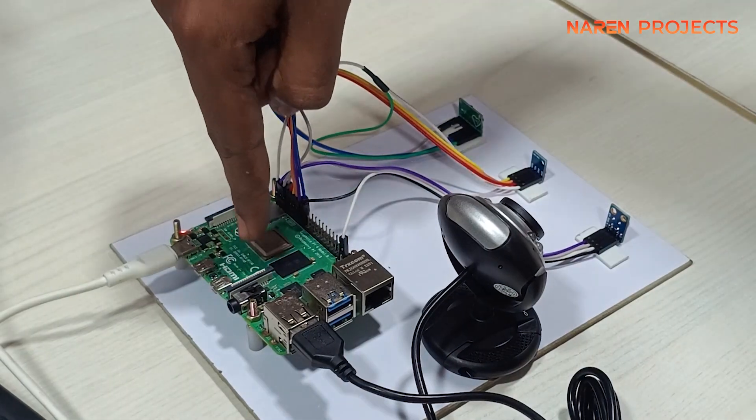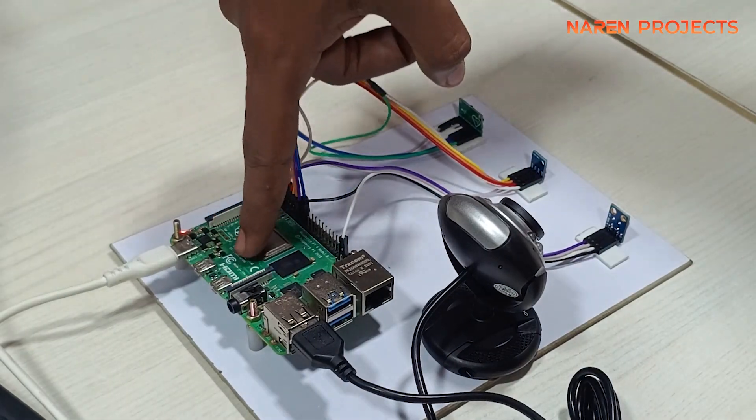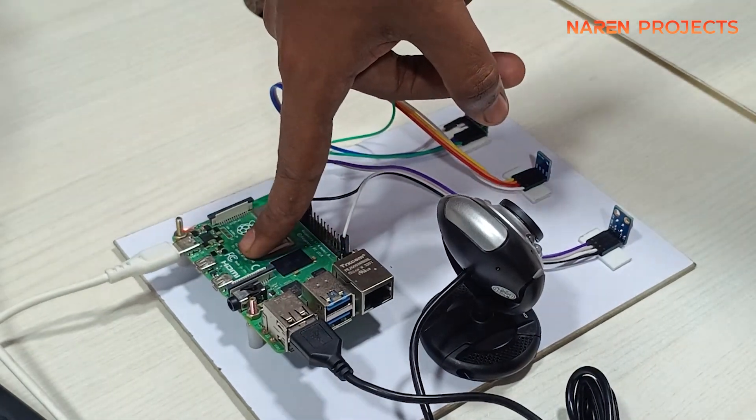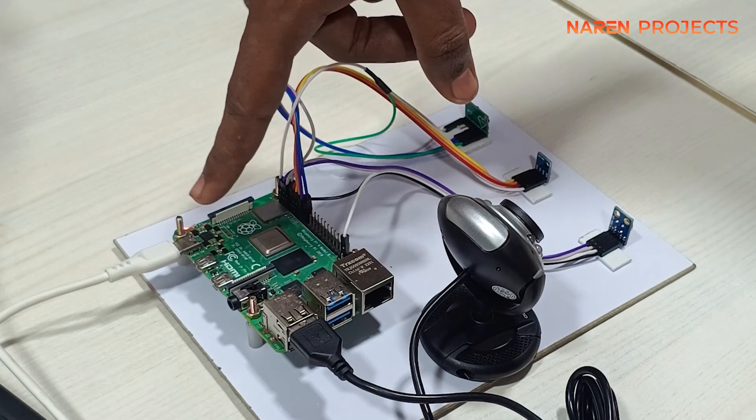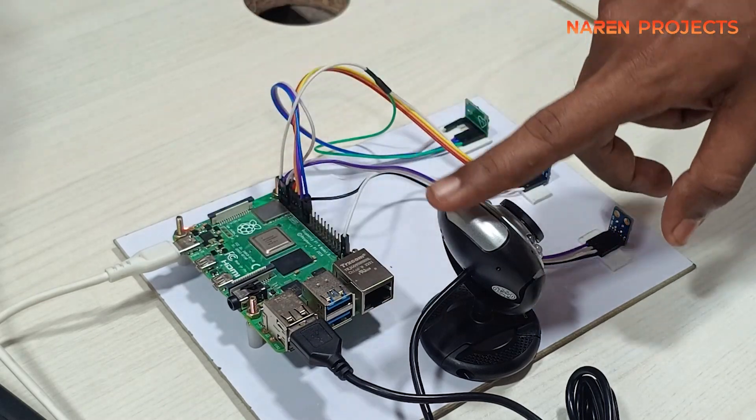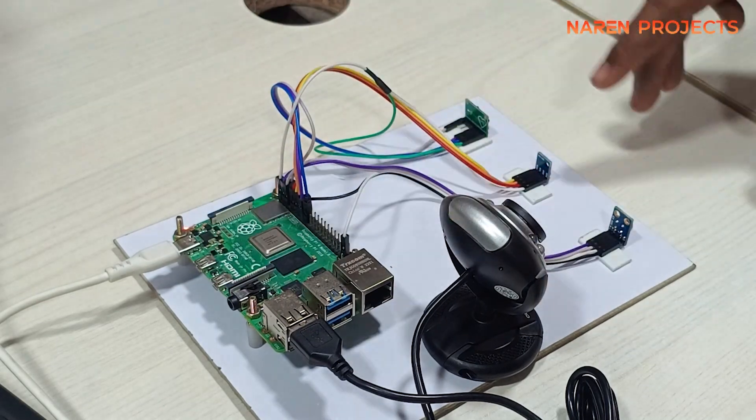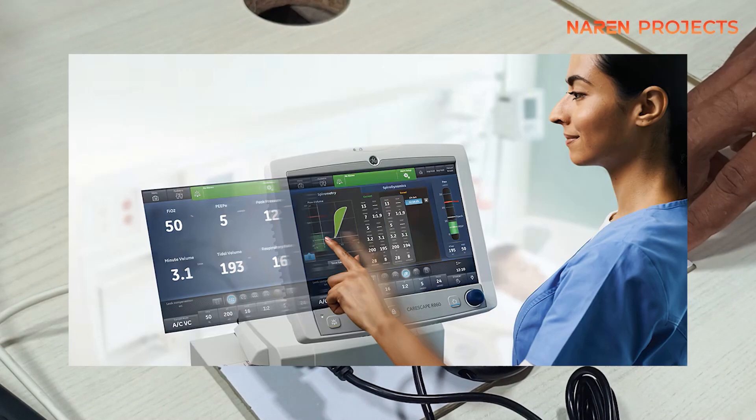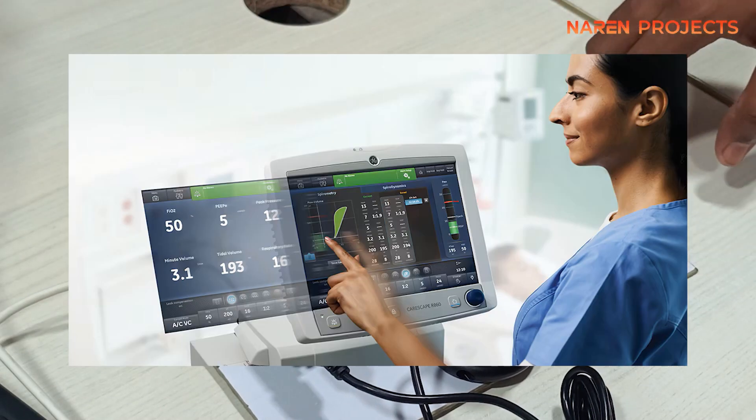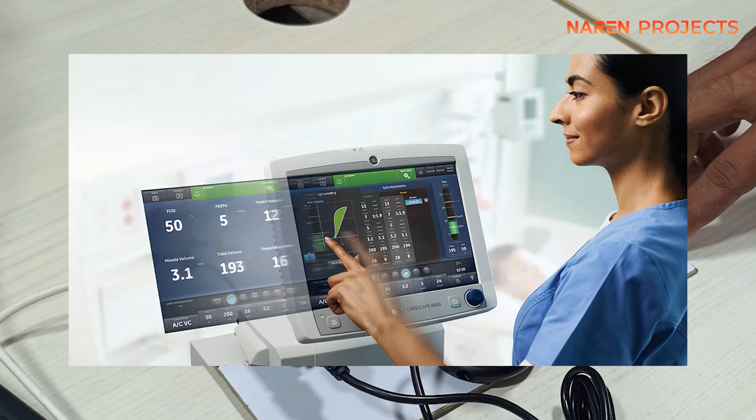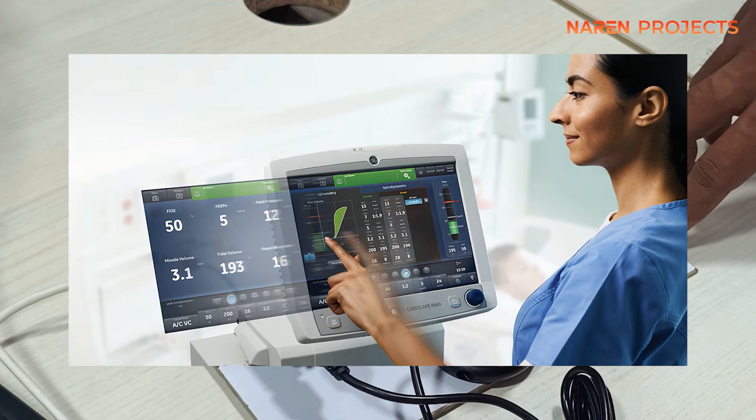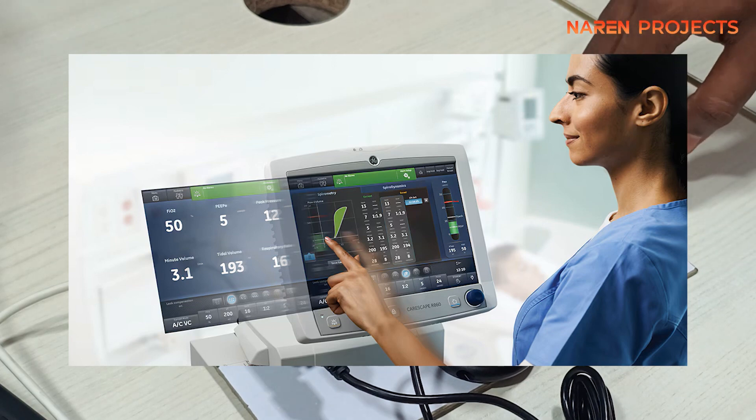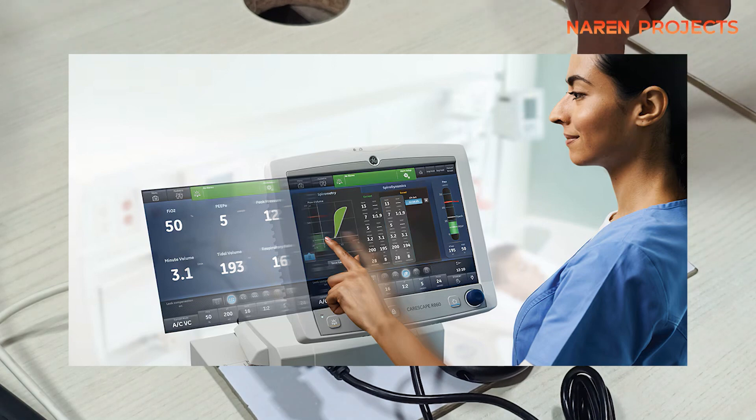Hello guys, today we are going to see a project demonstration of a Raspberry Pi based project: remote patient health monitoring system using machine learning algorithms.